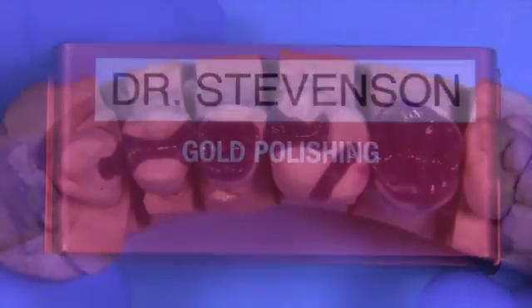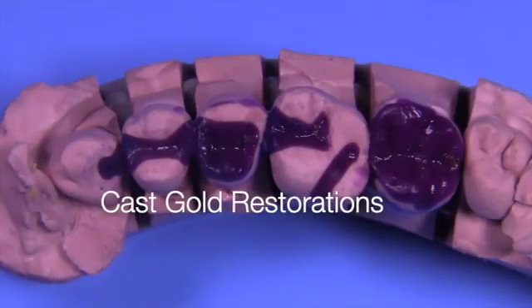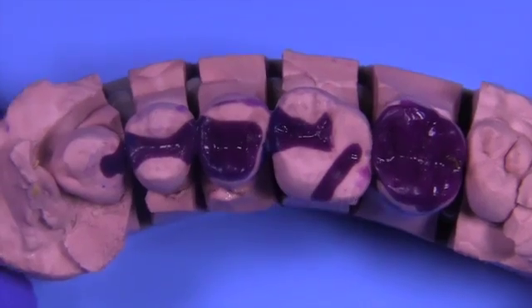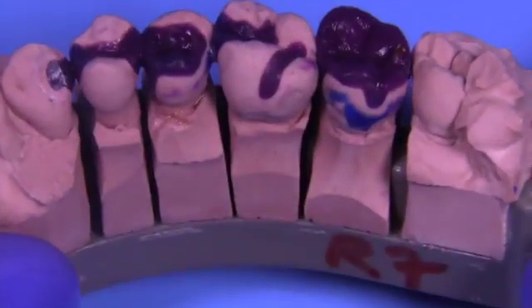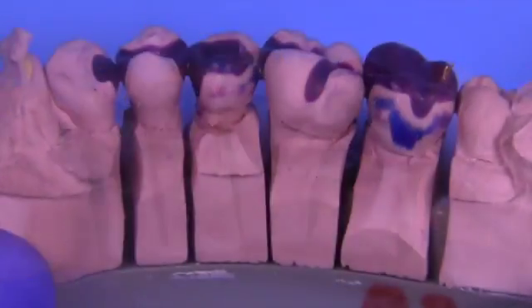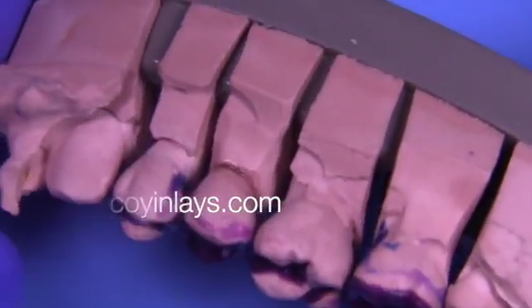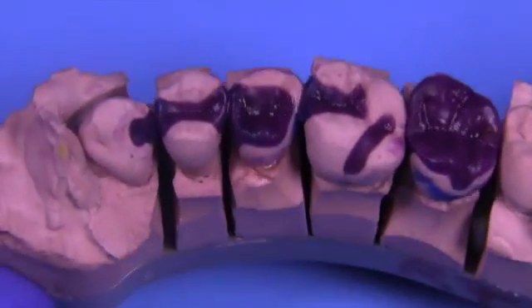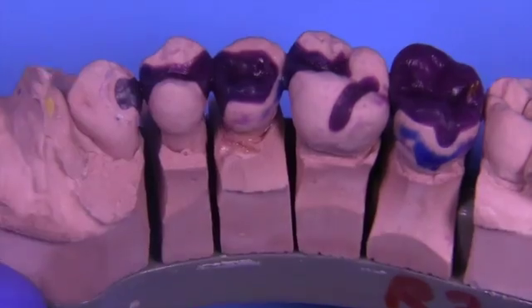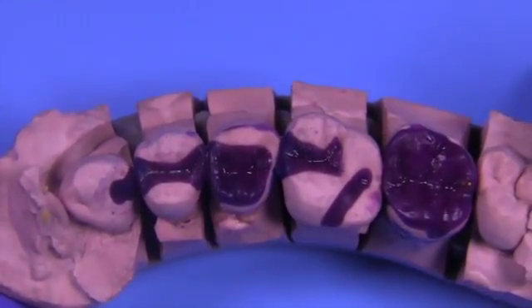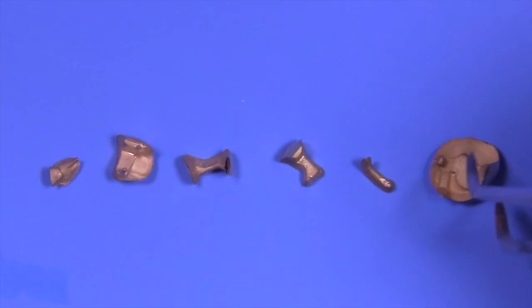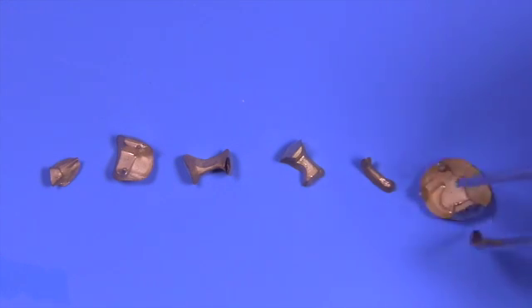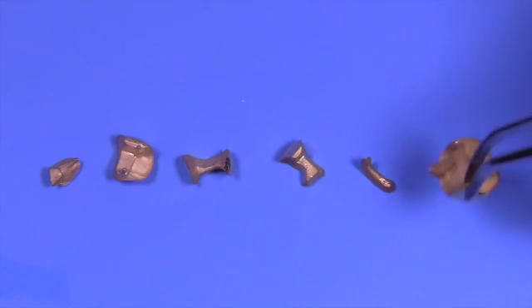These are the samples of the castings as waxed up that Coi Habich sent to me. He does beautiful work. His lab is temperature controlled, his countertops are temperature controlled, everything is weighed to a hundredth of a gram. He uses distilled water for everything to obtain castings that have this level of precision.